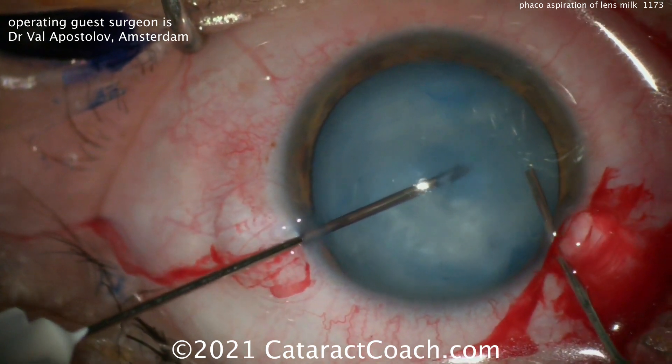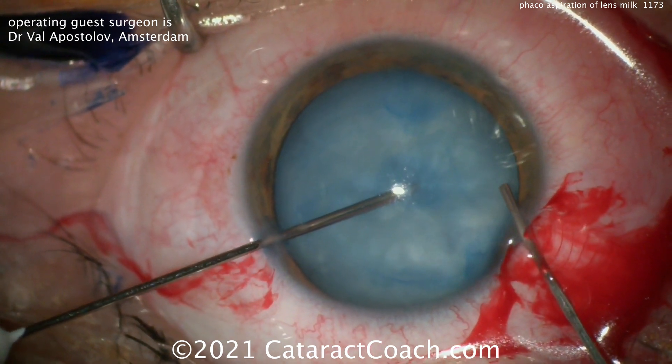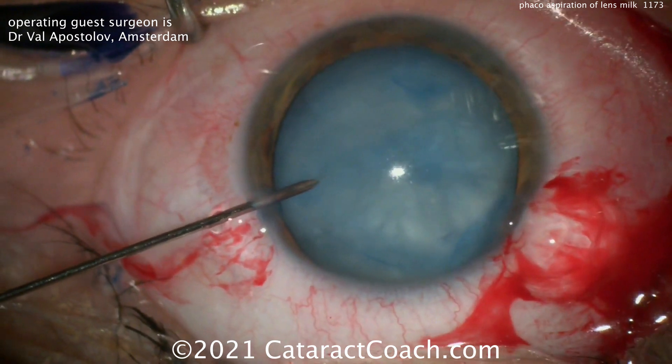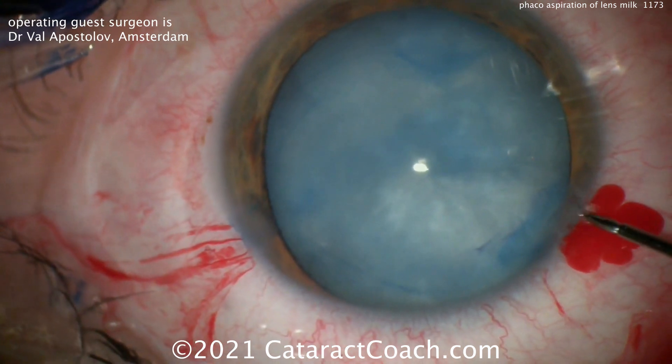Piercing the lens capsule so you can suck out or aspirate that milk. You can also do this with a syringe — we've shown Lukan Mishev who does that and we've learned that technique too — but in this situation you have it automated, so your foot pedal can control the aspiration.